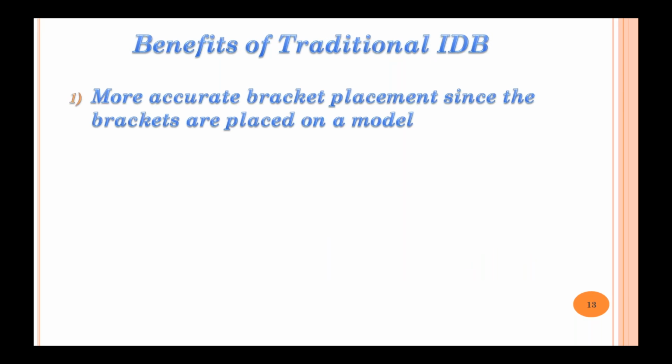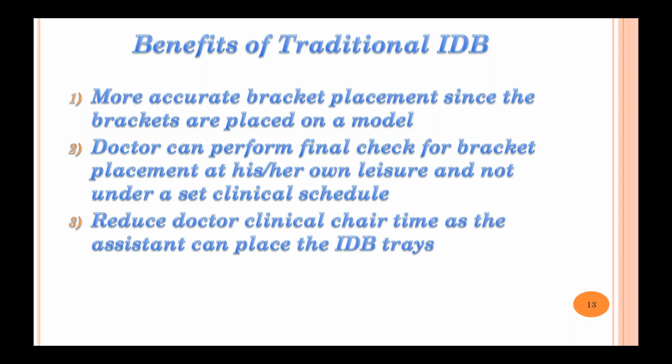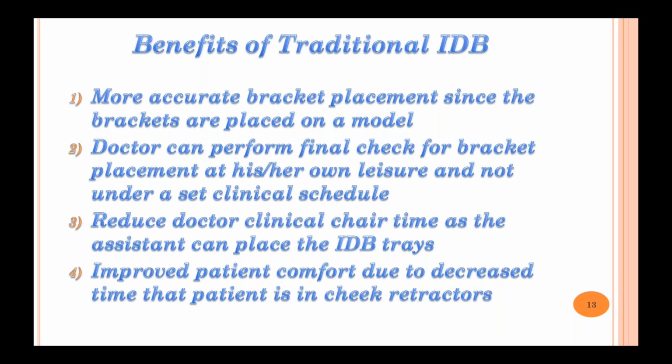So what are the benefits of traditional indirect bonding systems, especially that we have used since 1999 in practice? Well, claims have been made that it's more accurate bracket placement since the brackets are placed on a model. The doctor can perform the final check for bracket placement at his or her own leisure, not under a set clinical schedule, which is true. We could reduce doctor clinical chair time as the assistants can place the indirect bonding trays, and without a doubt, that is a key part of any indirect bonding system. If the assistants are doing that, we can be seeing other patients, doing other things, SureSmile setups, consultations, etc. It also improves patient comfort due to decreased treatment time in the chair, and that is without a doubt true as well.